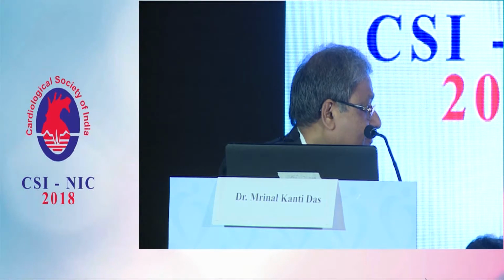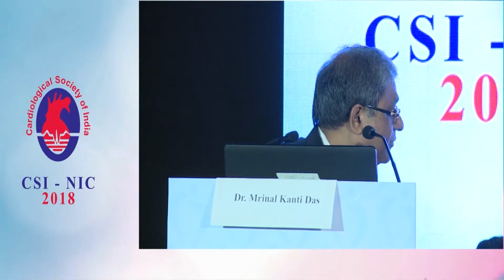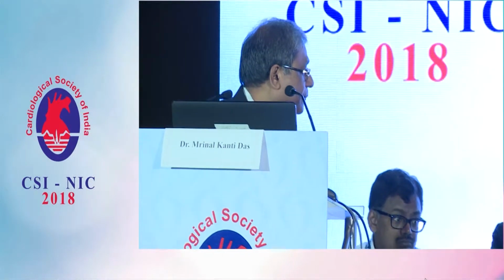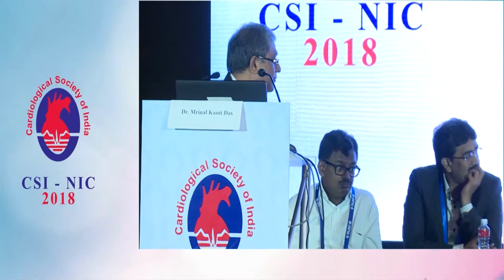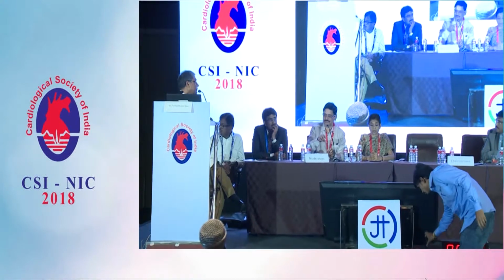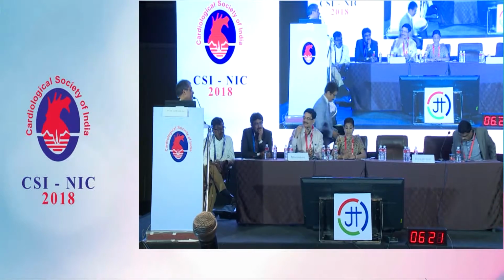Very good. Actually, what is the window period at which you intervened in this case, angioplasty, onset of chest pain? It was within an hour. So that's why I'm telling the same thing. Before balloon dilatation, if you do the thrombosuction, you won't get these situations, because we face these types of problems initially, and then we'll be in a dilemma. It is due to the distal embolization of thrombi, so that you won't see the landing zone. So that's why you have to see the microcatheter, and then you have to see the landing zone.